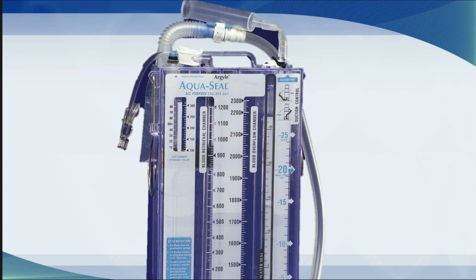The syringe that fills this is attached here on the top. You kink it and you pour in 20 ml of water. The last chamber on the right is the suction control, and that is filled to the level that you wish to limit suction, -15, -20, or -25. You fill the system up to 15, 20, or 25.